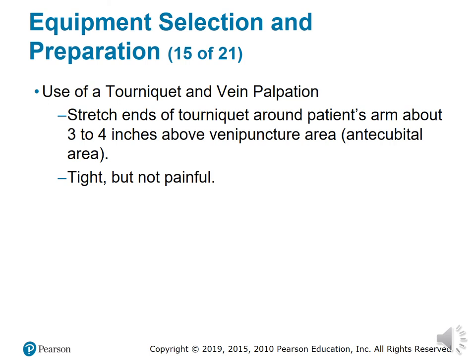All right? It's best to use your judgment when tying the tourniquet. Don't go off so much what the patient says. Again, you'll know if it's too tight on them. Like I said, you'll see the tourniquet start rolling up, you'll see the skin tightening up around it, the skin starting to look dry.